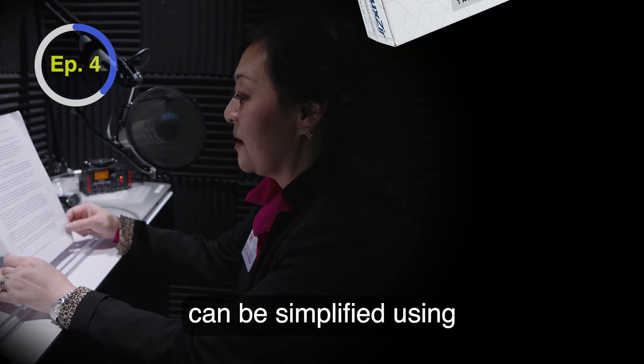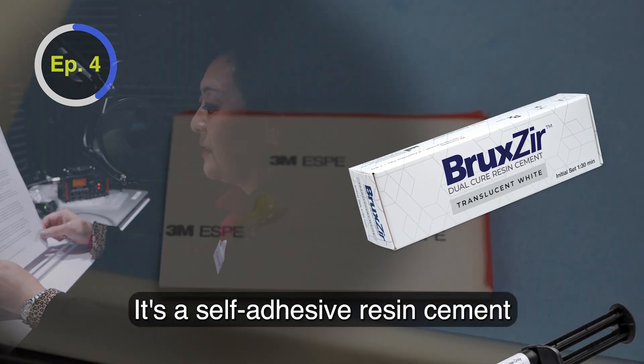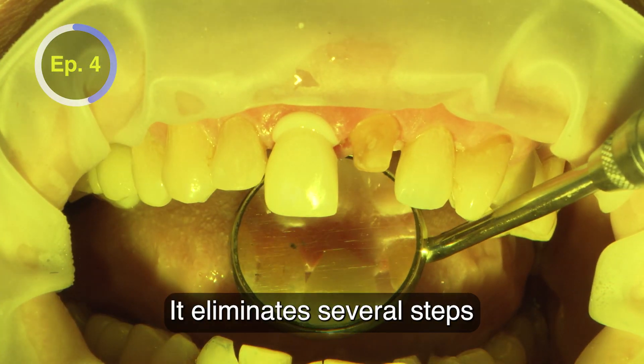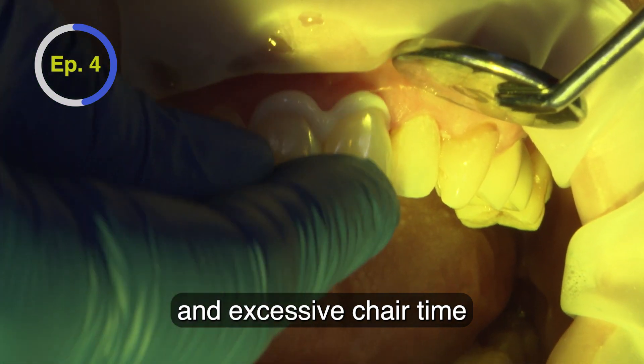Cementing zirconia can be simplified using BruxZir Dual Cure Resin Cement. It's a self-adhesive resin cement that is versatile, color-stable, and efficient. It eliminates several steps in the bonding protocol, saving money and excessive chair time.